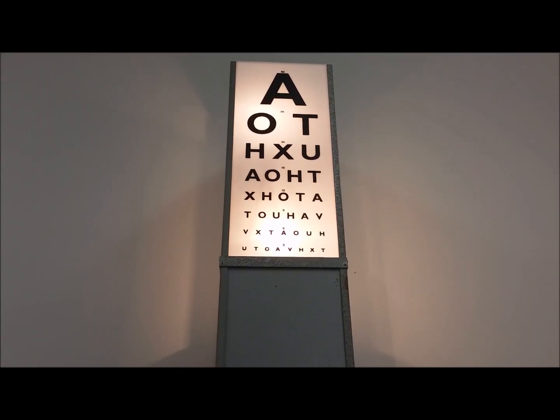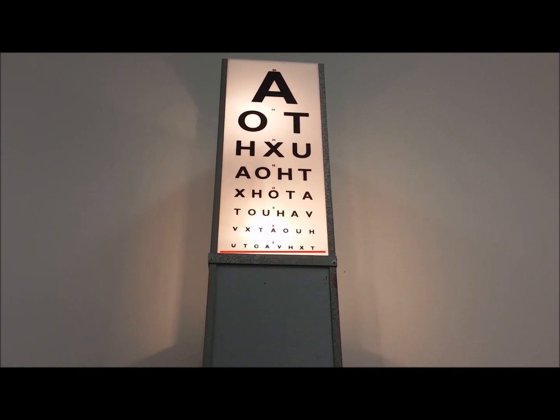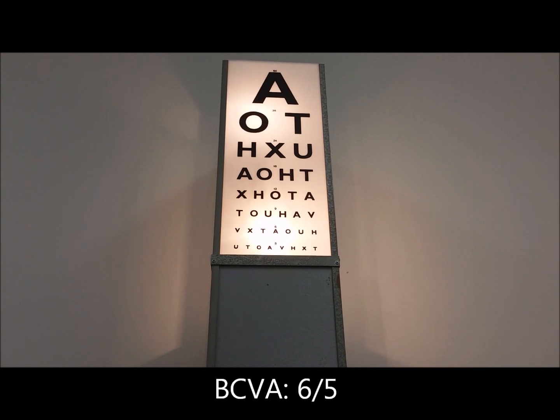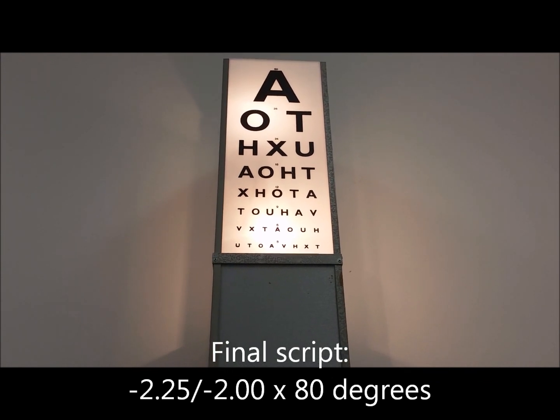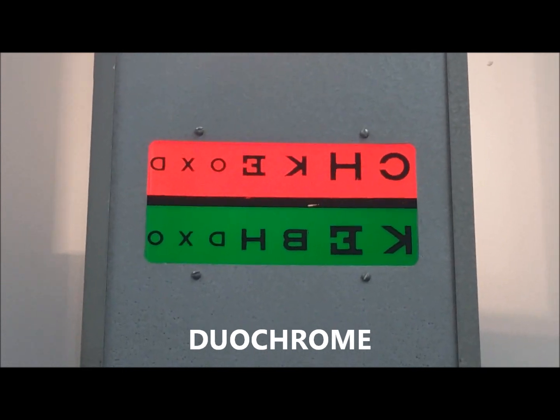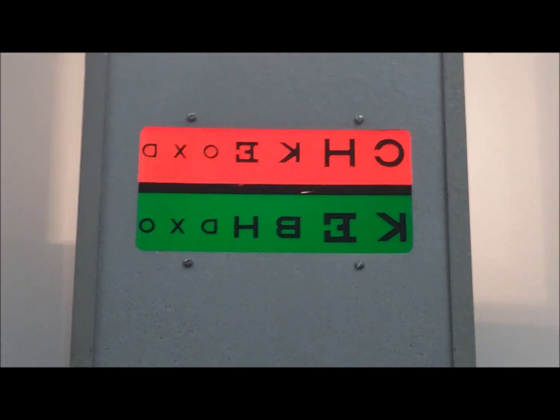Alright, Hongbin, so I just want you to tell me again what's the lowest line you can read down from now. U T O A V H X T. Hongbin has achieved best corrected visual acuity of 6/5 with a script of -2.25 with -2 at 80 degrees. To check that the patient has not been over or under corrected, the duochrome is used. It is based on the principles of chromatic aberration of the eye and is performed monocularly.